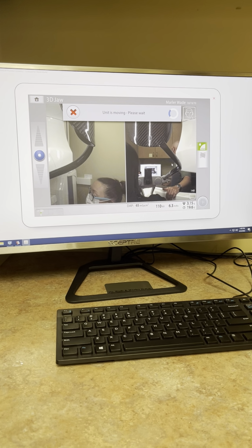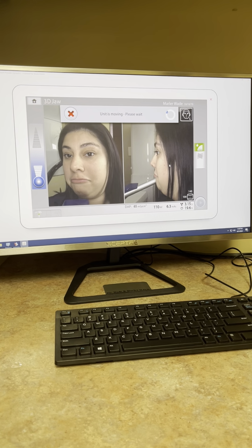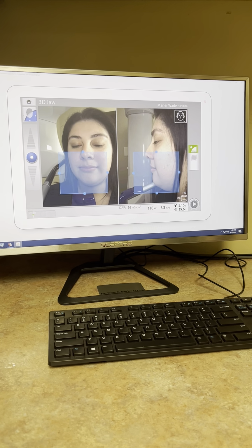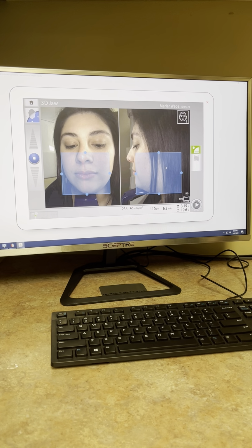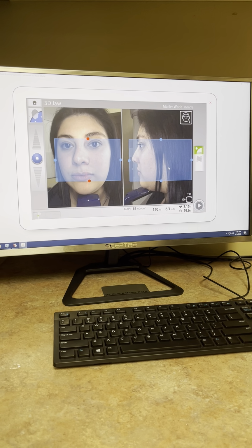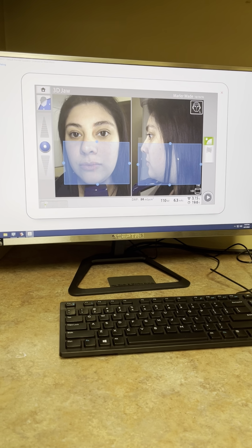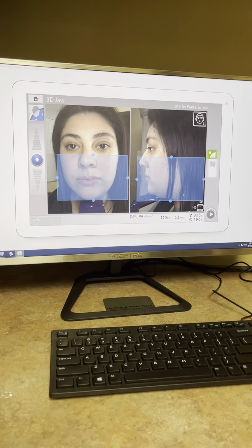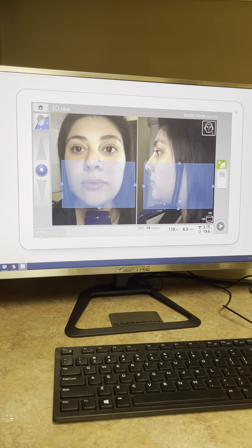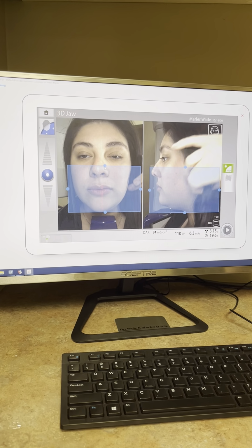Hit your forward arrow button as the patient is in there. I'm going to lower this. Hi, Jade. Now that she's come in, put your hands here and just hover above it, that's fine. Bring this in. Just let your head sit back of it. And then from here you can come over and adjust this as you need. For the patient, this is where you just want to get her whole jaw in there, from the back of her condyle to the tip of her nose, from the chin to the back. If you need this a little taller, I don't know if you guys are doing that or not.